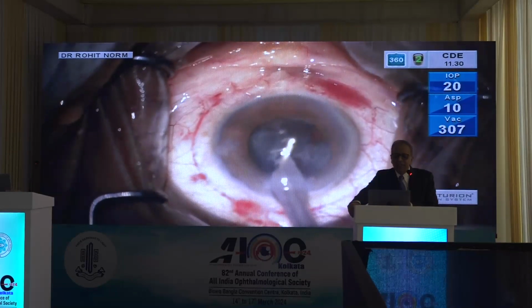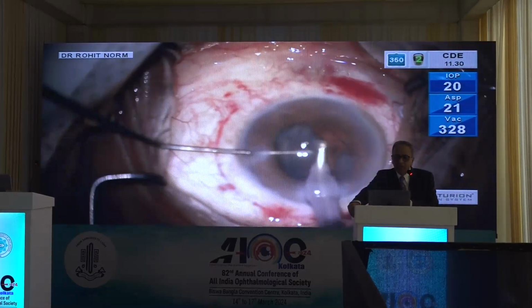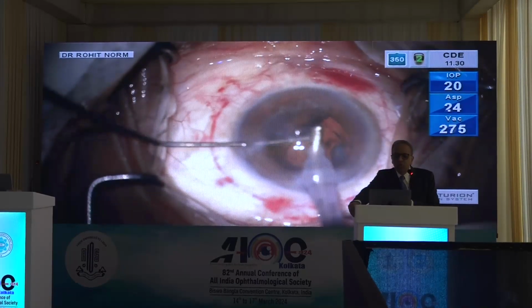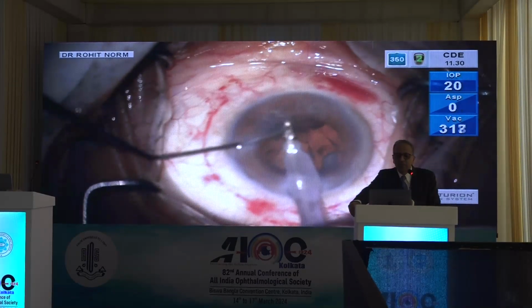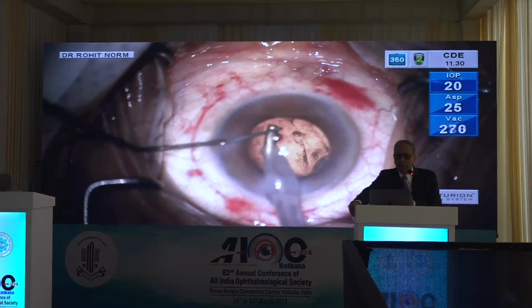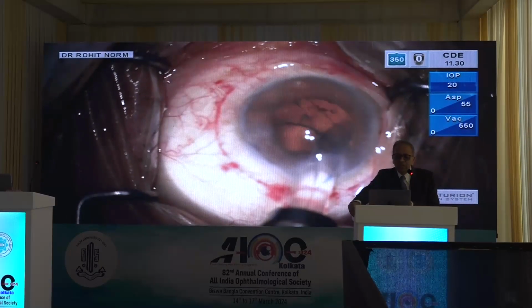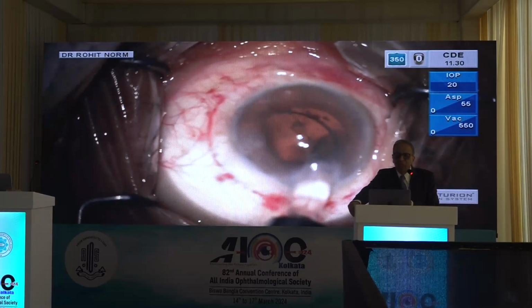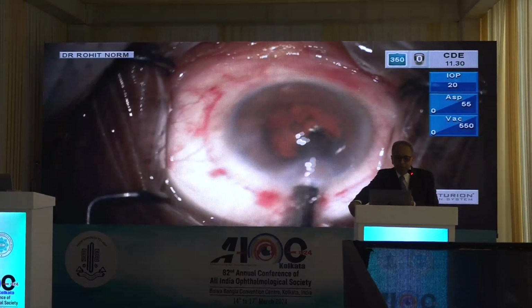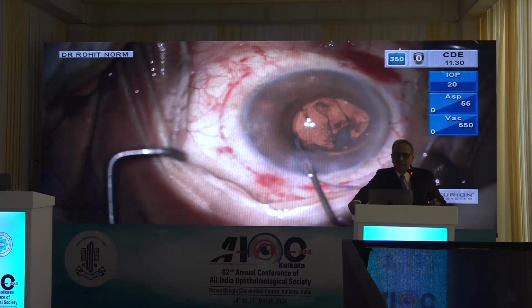And since it is difficult at times, it is going around at a very slow pace. And I'm trying to just stuff it in so that I'm able to do total aspiration of the posterior part of the epinucleus. Once that is done, I implant an intraocular lens, which in this case would be a 3-piece. I did not venture into going in for a single piece and doing reverse optic capture, because I was not comfortable at that point of time.